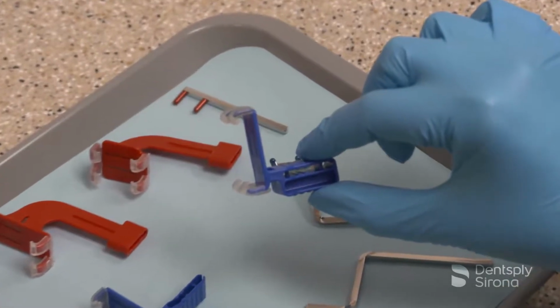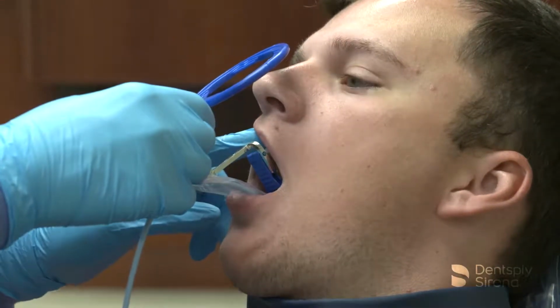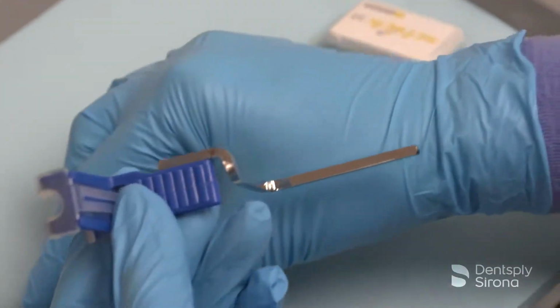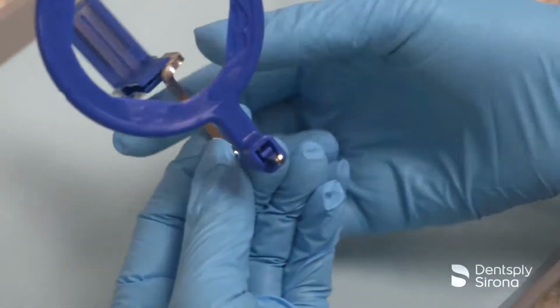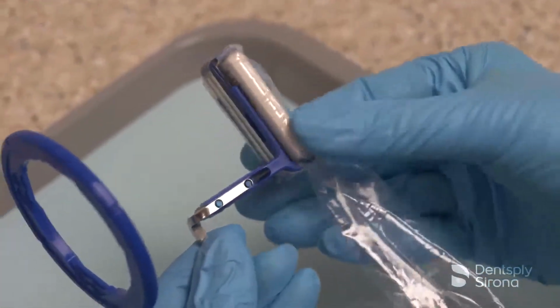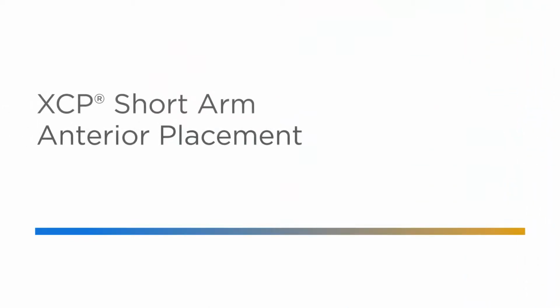There are 2 options for anterior bite blocks, a thicker bite block and a thin bite block, which makes it easier to place in the patient's mouth when using a size 2 sensor. To assemble the XCP Short Arm with the XCP DS Fit anterior bite block for images, place the blue pins on the arm into the side of the blue bite block and slide the arm into the blue aiming ring. After placing the sensor into a RINN digital sensor cover, securely insert the sensor into the blue bite block, making sure that the active side of the sensor is against the flat surface of the bite block.